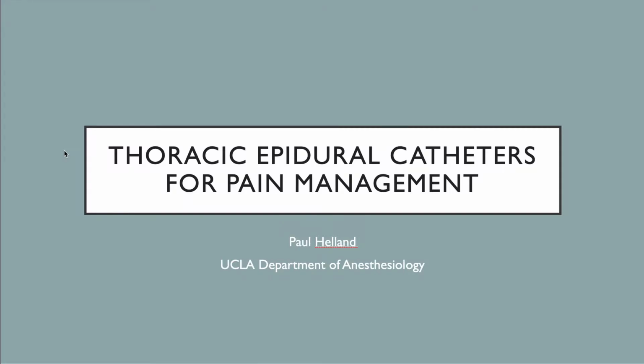Hello, my name is Paul Helland. I'm an anesthesia resident here at UCLA Medical Center. This video will go over thoracic epidural catheters for residents rotating on the acute pain service.